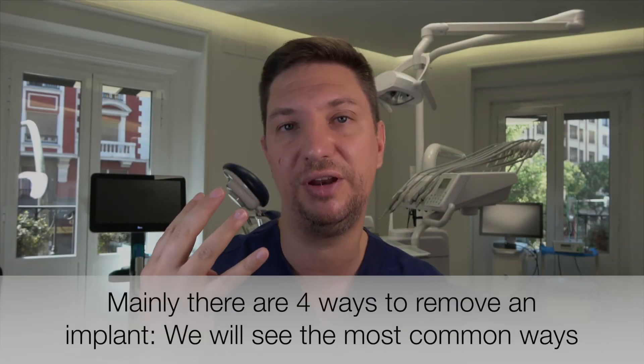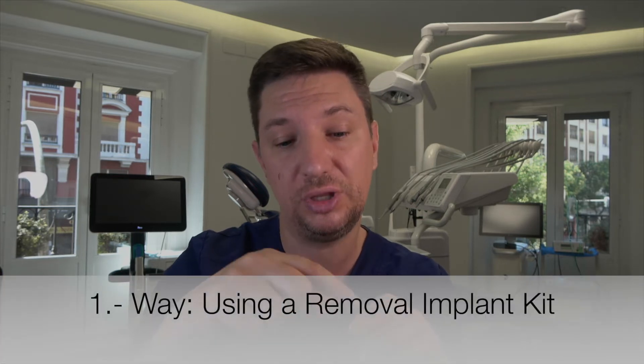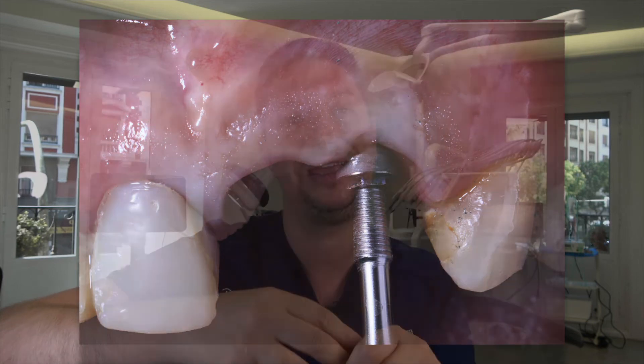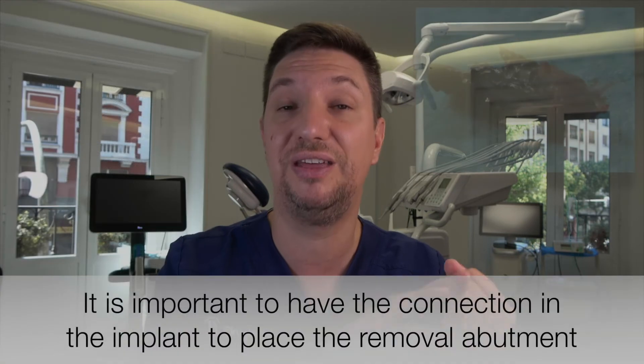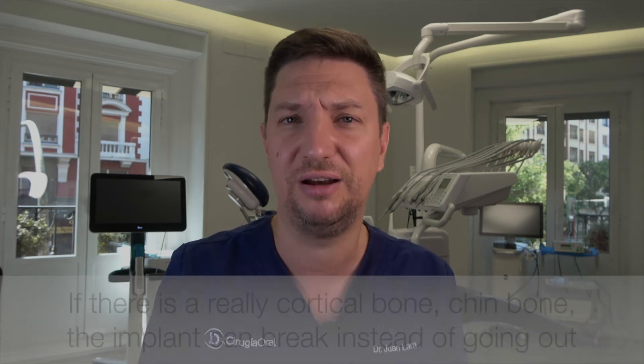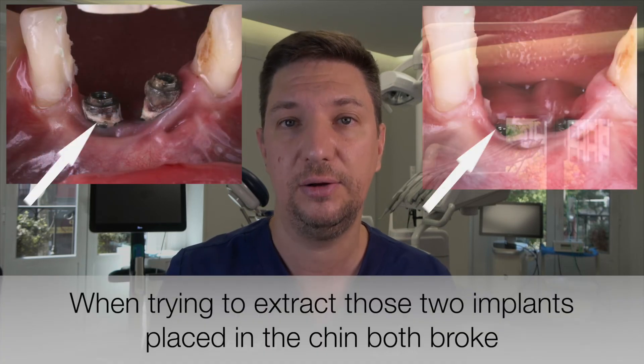There are four ways to remove an implant. The first one is with a removal kit — you screw the abutment into the implant, and then the implant will come out of the bone. We have two problems with that. First, we need an implant with a connection — if the fracture is below the connection, we cannot use this method. The second problem is that sometimes the bone is really cortical, for example in the mandible. If we have very cortical bone, it's going to be impossible to unscrew the implant with the kit removal.